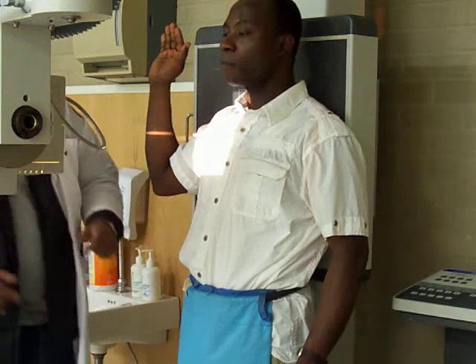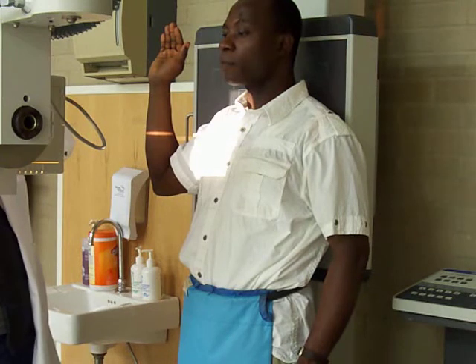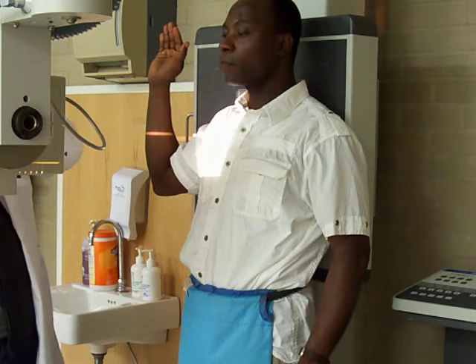Change the collimation — with a 10 by 12, long side.